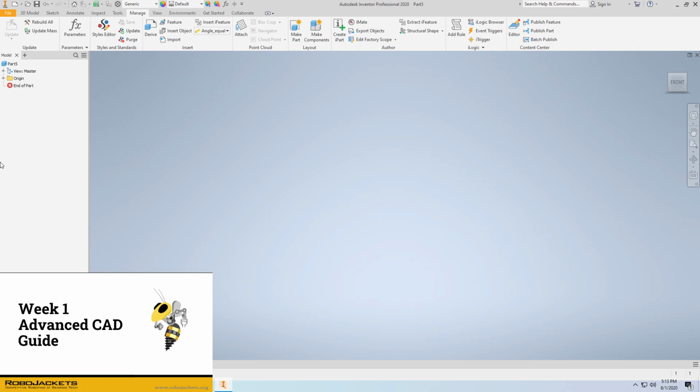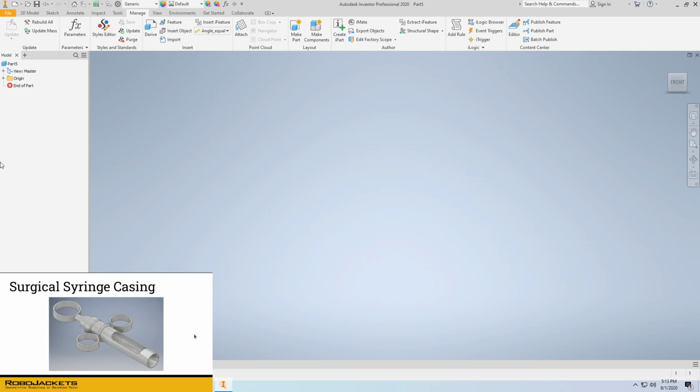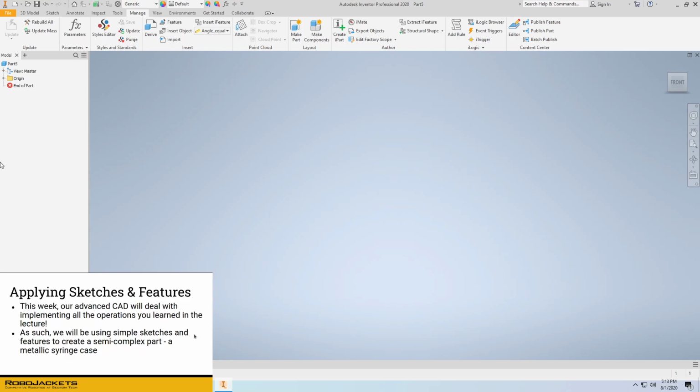Hey guys, welcome to week 1 Advanced CAD Guide, where we're going to start combining some of the things we've learned to create a little bit more complex CAD. The gist is you'll be creating a surgical syringe casing with uncertain parameters. You'll be creating complex features using just simple sketches and show how we can create advanced things with what we know right now.